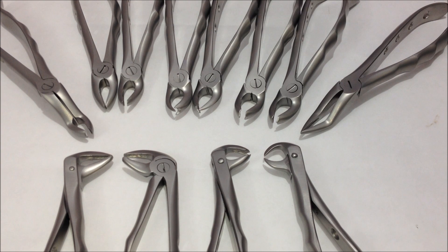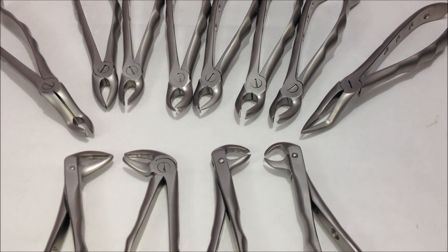Here is a demonstration of the extraction forceps which are used in the dental clinic for the extraction of various teeth. This is a complete kit of extraction forceps that is used for the upper and lower teeth.